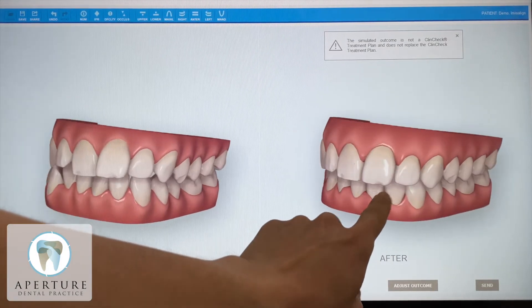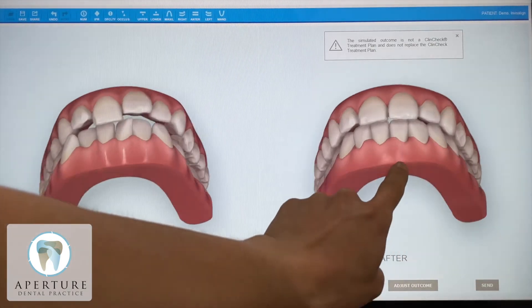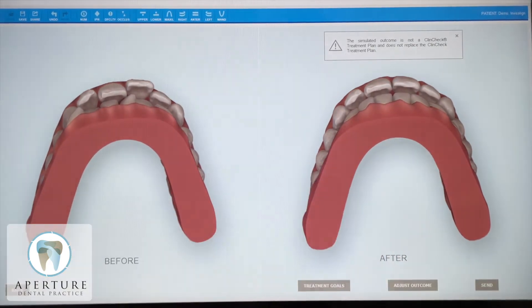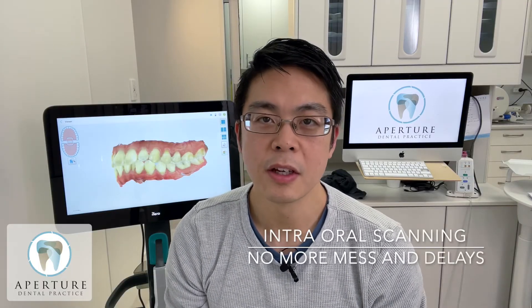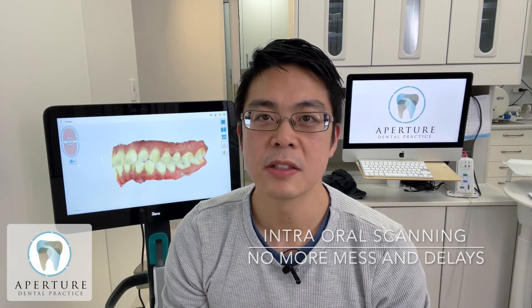The best thing I like about it is the experience that it gives you. We used to take moulds of the teeth to send to Invisalign, which some of you may know can get messy and uncomfortable, but now this scan can be sent with a click of a button. No more messy cleanups, inaccurate impressions, delays or lost postages.